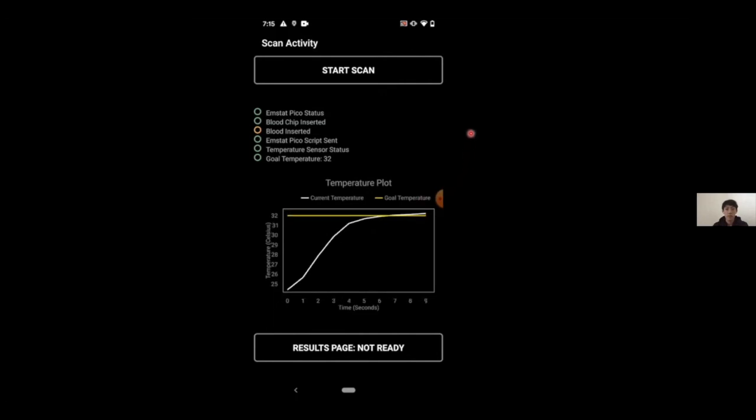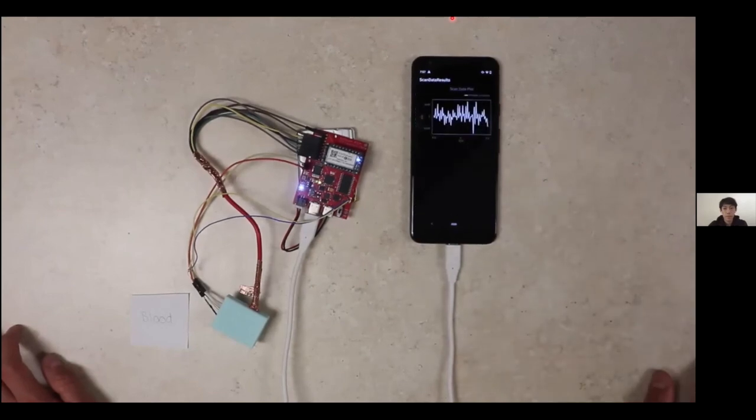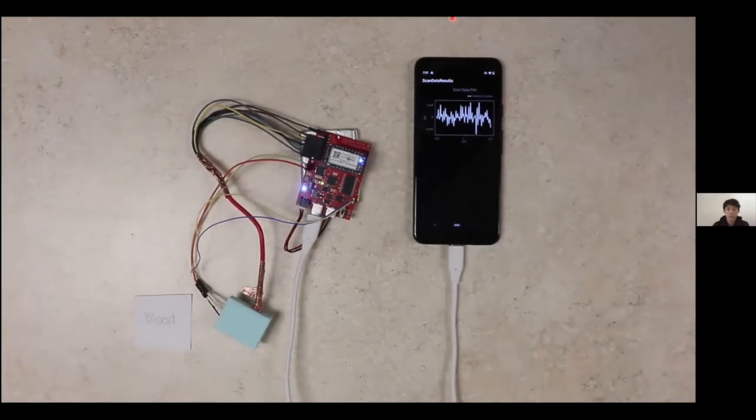Once the current temperature is within 0.3 degrees Celsius of the goal temperature for more than a couple seconds, this starts the EmStat Pico scanning process that's happening right now. Now the results are ready from the Pico. We now click this button, and the results are now displayed on this screen. This data now feeds into Aptitude's coagulopathy measurement engine.